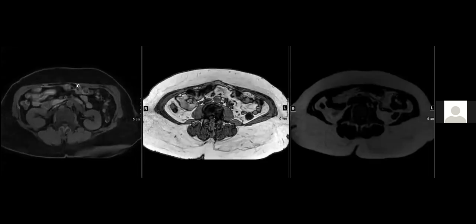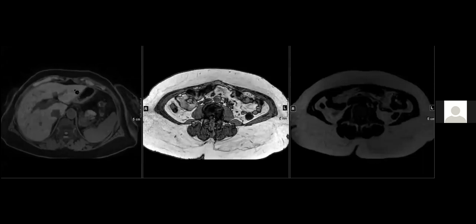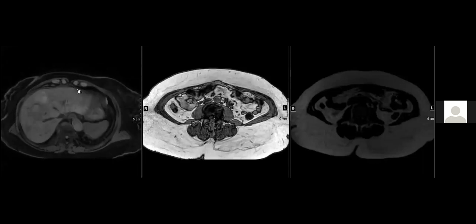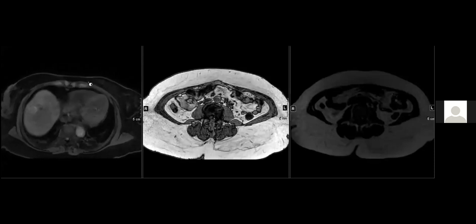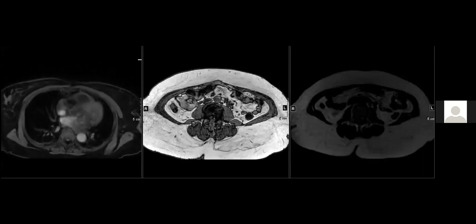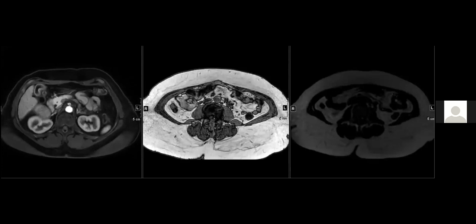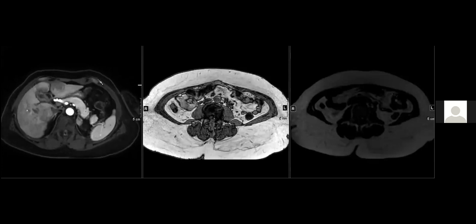This was a real case where the surgeons called me and said, okay, we have this patient, she's cirrhotic, and they basically said the patient has multiple metastases. Can you please help us? Do we really need the biopsy?